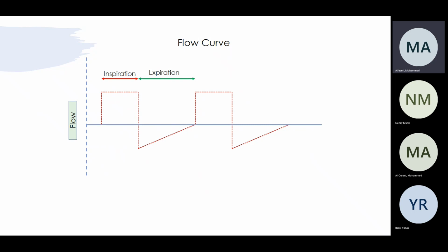So flow right now. Dr. Megri, if it's constant, why even talk about it in volume control, is that right? If it's constant, how can we use the flow? Yes, we can use the flow to calculate the resistance. That's one. And why are we looking at the flow? Something about the elasticity of the lung, and the resistance is another. If there is auto PEEP, we can tell from the flow.